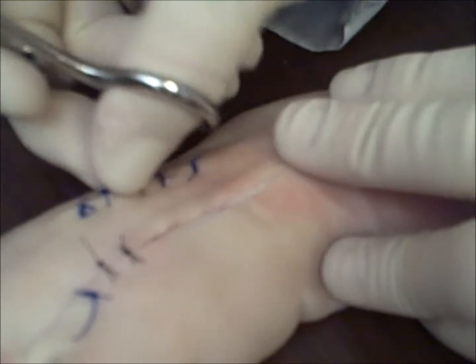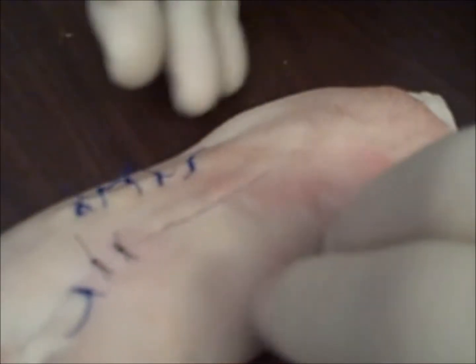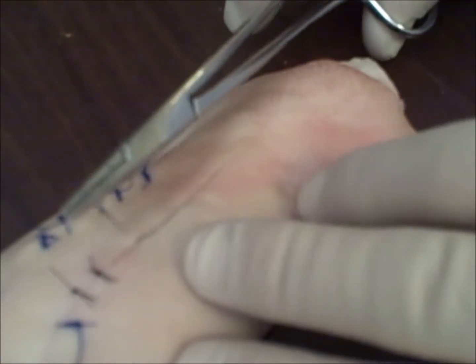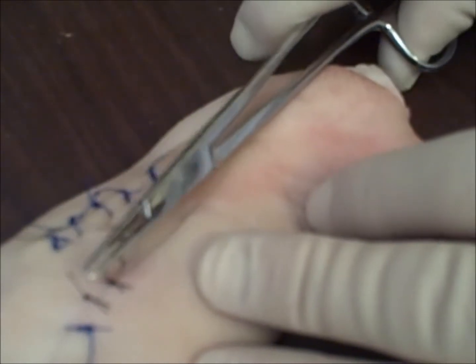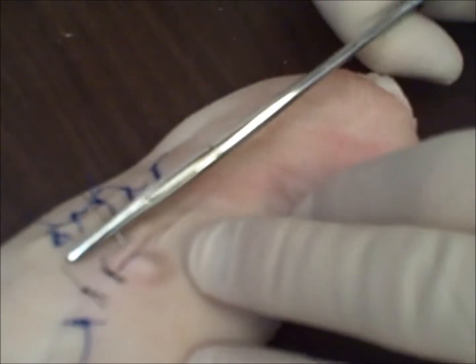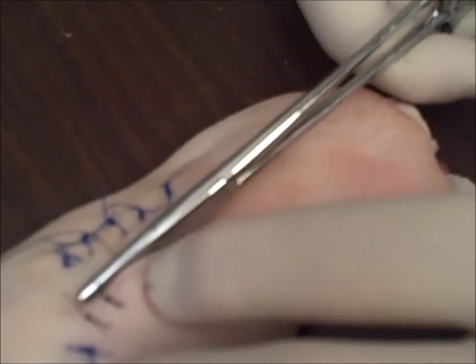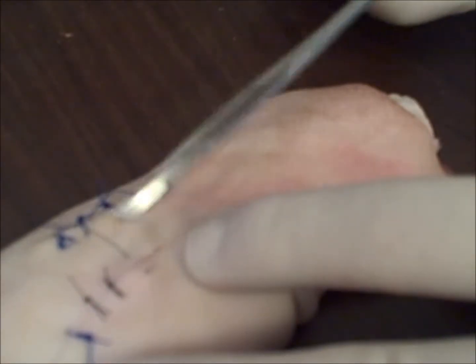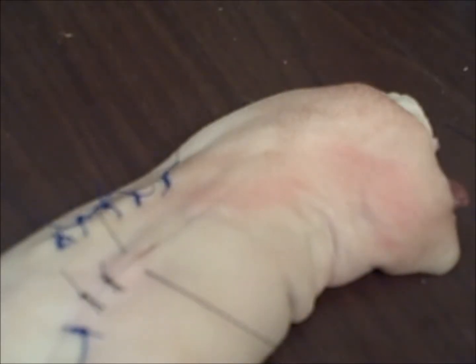The blue stuff over here — these sutures — that's the polypropylene that's kind of hard to work with. I prefer the silk. So we're going to start about 2 millimeters to the side of the wound, push through, and come up the other side. Pull that through almost to the end.